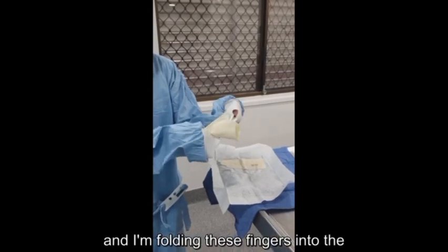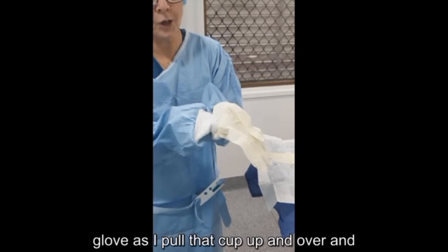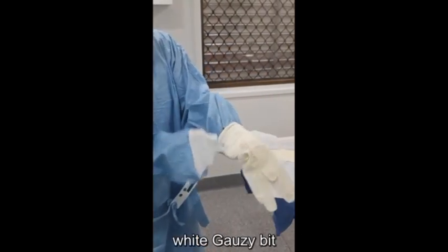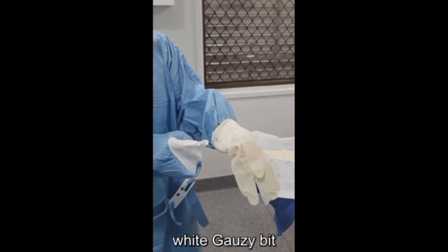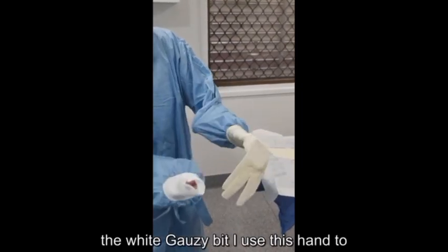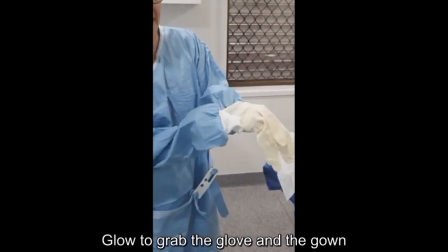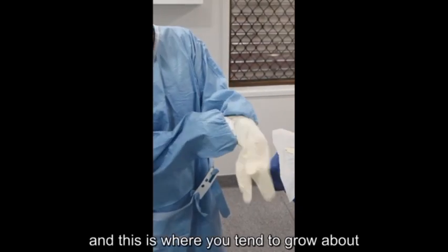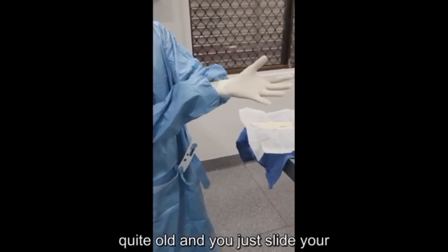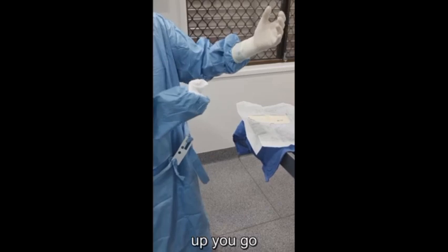I'm folding these fingers into the glove as I pull that cuff up and over, and I'm trying to pull it up and over the white gauzy bit. At that point, once this glove is over the white gauzy bit, I use this hand to grab the glove and the gown. And this is where you tend to grow about 10 different fingers, trying to get into 5 holes, and you just slide your fingers in. Right, and then up you go.